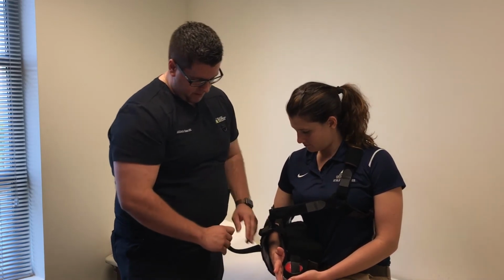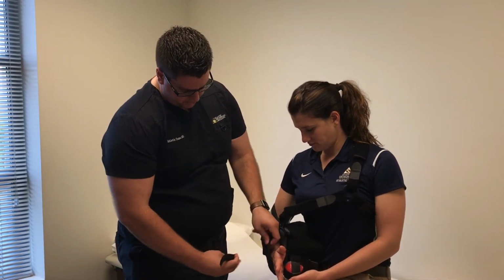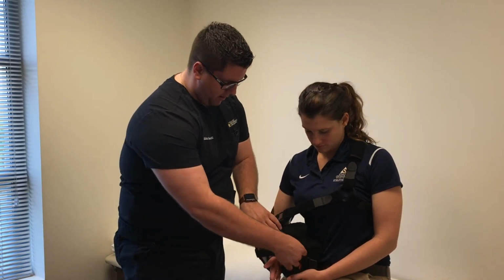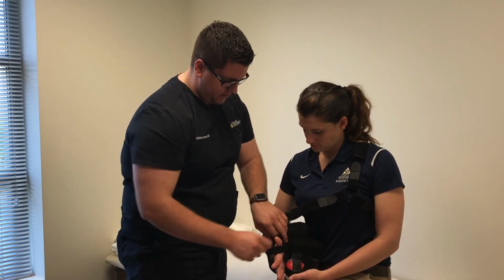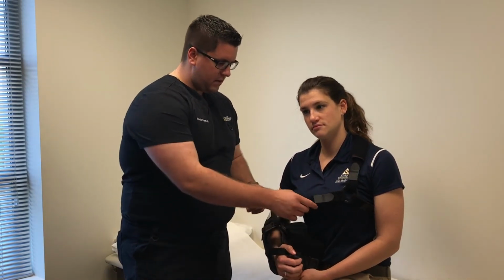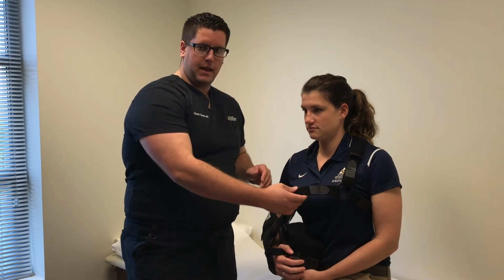And you can reapply the thumb strap, which will just go up here in the front, just like so. And we'll come around and wrap underneath the thumb for just some support. And then she has the ability to use the squeeze ball as well. And then obviously there is some play here.